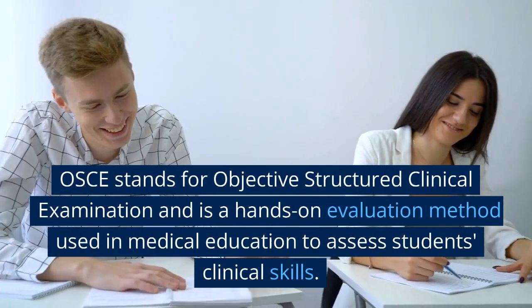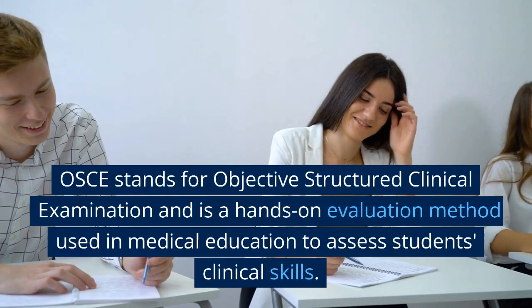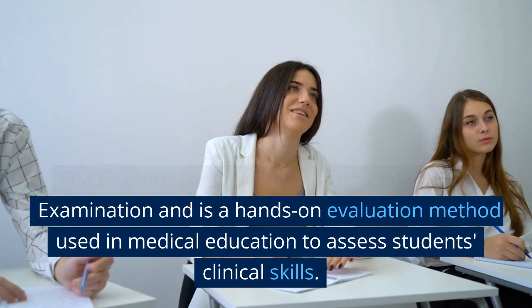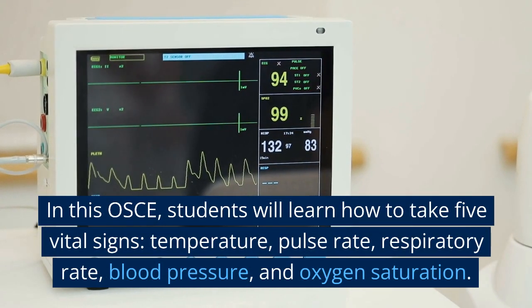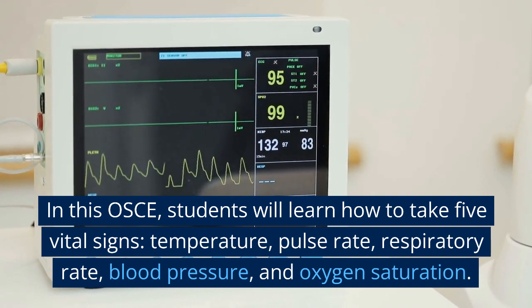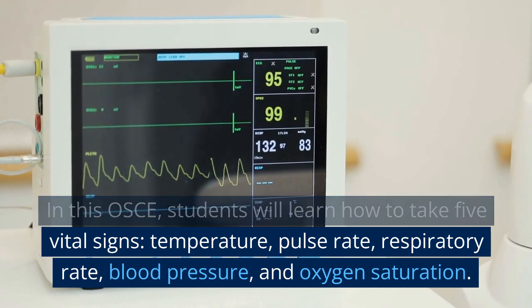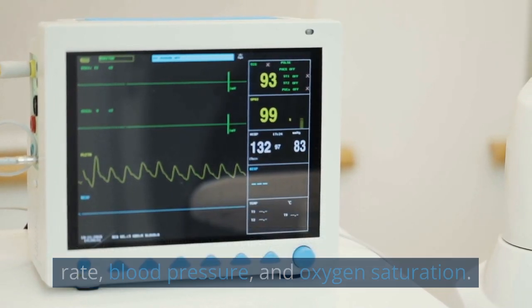OSCE stands for Objective Structured Clinical Examination and is a hands-on evaluation method used in medical education to assess students' clinical skills. In this OSCE, students will learn how to take five vital signs: temperature, pulse rate, respiratory rate, blood pressure, and oxygen saturation.